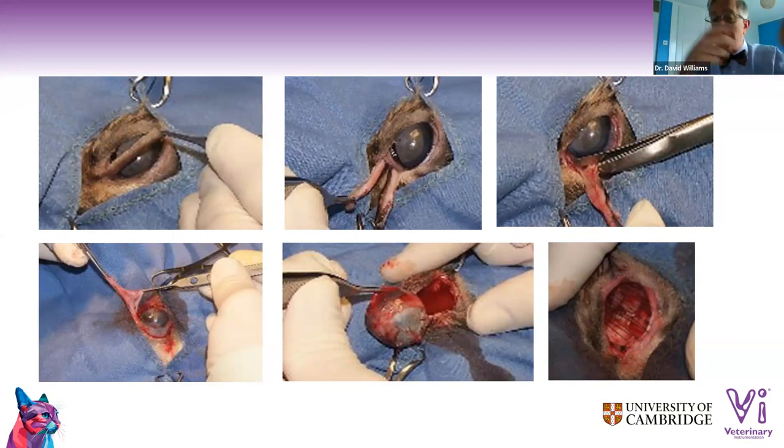So once you've taken the eye out, I would put a swab in there and then cut the eyelids out. And once you've cut the eyelids out, it can be a bit tricky cutting them out right at the medial canthus, but it's doable. Then take the swab out, and in the vast majority of cases, there's just a tiny bit of ooze, no more than that. And then, as we've seen done on the lower right here, do a pattern of sutures across. Actually, what I do, I keep enough of the conjunctiva that the sutures, rather than there being twanged across it, just close those together like a drum over the surface.